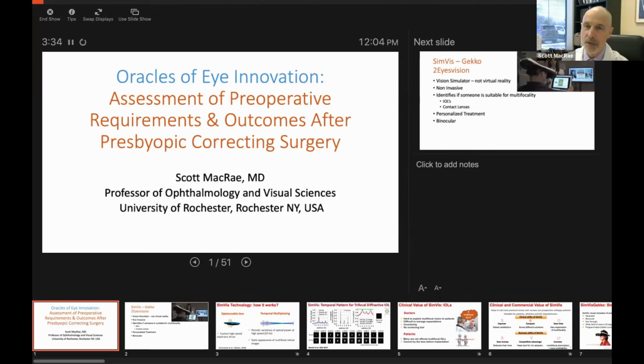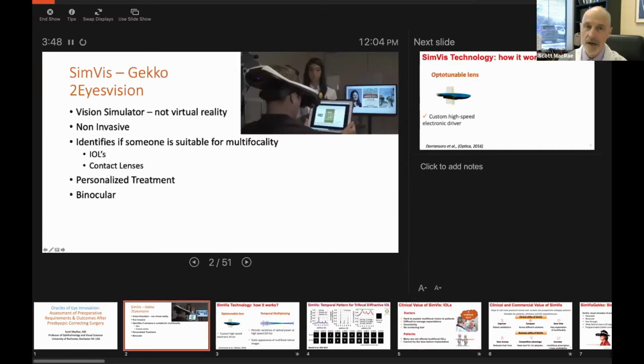Today, I'd like to talk to you about some of the assessment of preoperative requirements and outcomes after presbyopic cataract surgery. And in particular, I want to share with you some work that's been done with SimVis Gekko by Two Eyes Vision. This is a system that was developed by Susana Marcos and her group in Madrid. Very exciting system, which allows visual simulation.